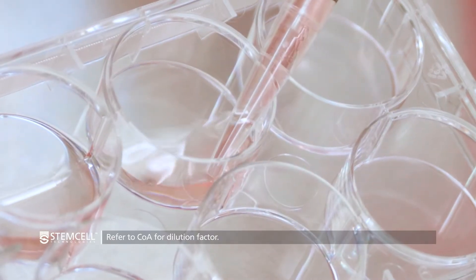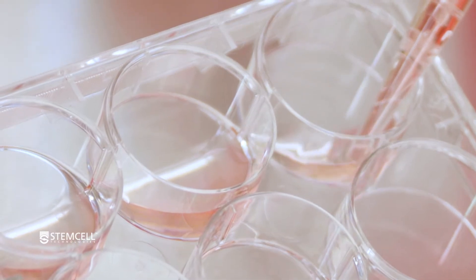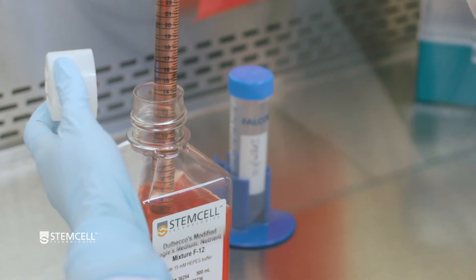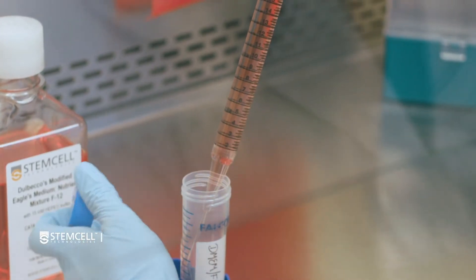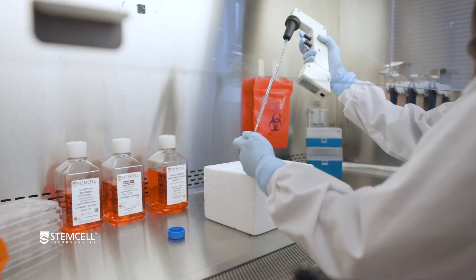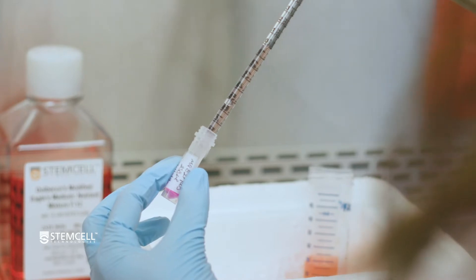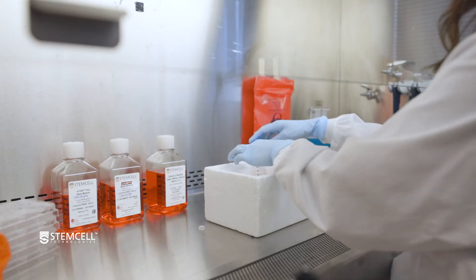For coating with Corning Matrigel, the certificate of analysis supplied with each lot will recommend an aliquot size or dilution factor to make up 25 milliliters of diluted matrix. First, thaw an aliquot of Matrigel on ice. Make sure to keep Matrigel on ice when thawing and handling to prevent it from gelling. Dispense 25 milliliters of cold DMEM F12 with 15 millimolar HEPES into a 50 milliliter conical tube and keep it on ice. Next, take 1 milliliter of the cold DMEM F12 from the conical tube and add this to the aliquot of thawed Matrigel on ice and mix well. Then transfer the full volume of the aliquot into the conical tube containing the remaining DMEM F12 and mix well to ensure a homogenous solution of diluted Matrigel before placing the tube back on ice.